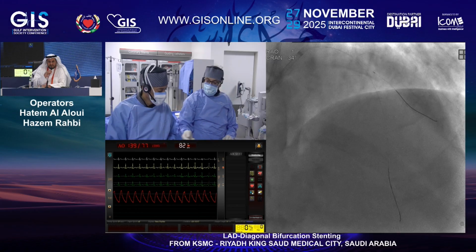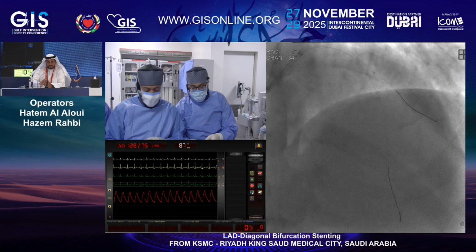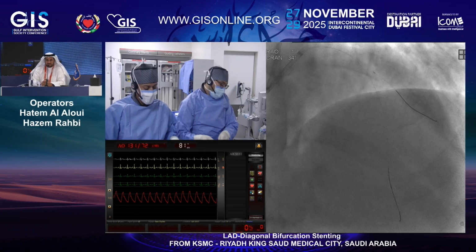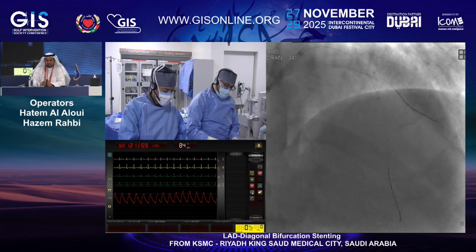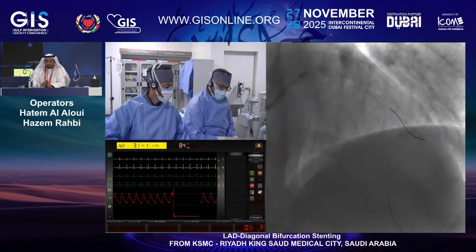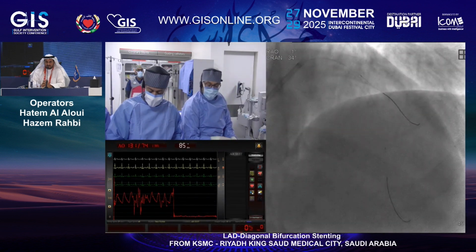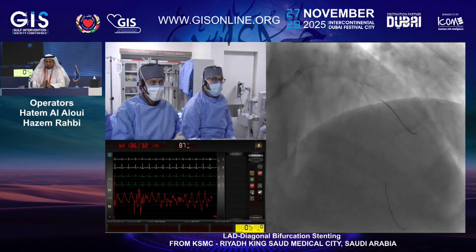special balloons, scoring or cutting, so that we don't go very high in terms of pressure, and to have a controlled dissection. We don't want to go with a high pressure 1-to-1 NC balloon and have spiral dissections. We prefer going low pressure with specialty balloons to have a controlled dissection and to allow the drug, if ever we will be putting a drug-eluting balloon, to go deep in the vessel wall.